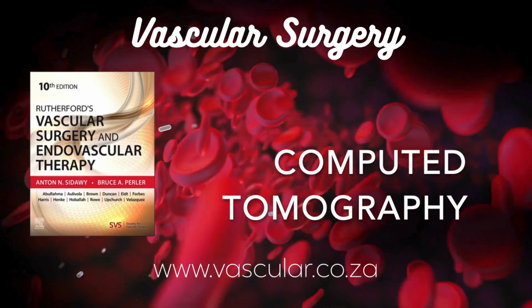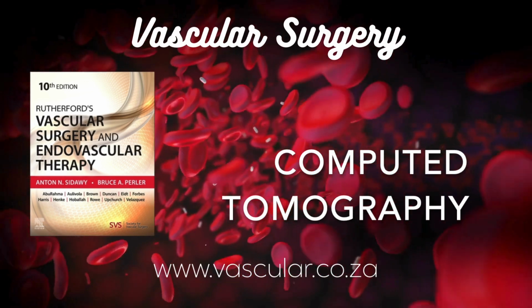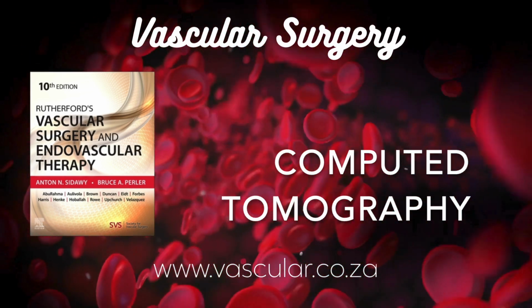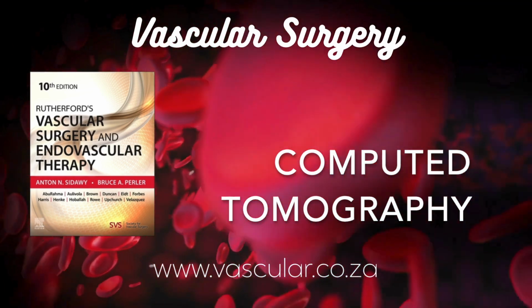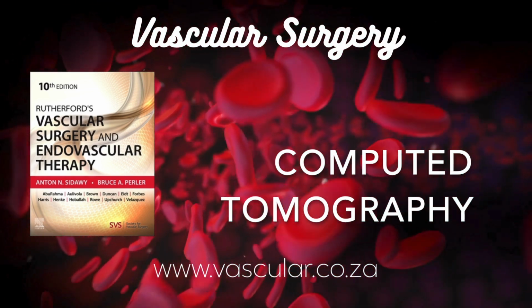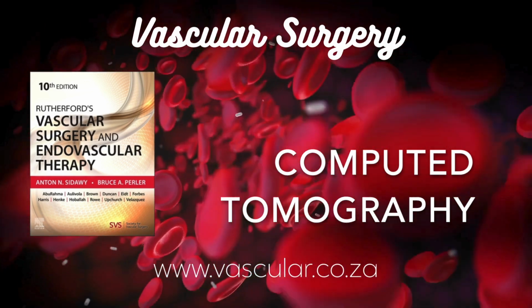Carotid stenosis. CTA is very accurate there too. It's often less bothered by heavy calcification than ultrasound might be. It gives great anatomical detail and can usually distinguish a complete blockage, occlusion, from a very tight stenosis better than ultrasound. Plus, you can often extend the scan to include the aortic arch where the carotids originate, and even look at the arteries inside the head if needed.